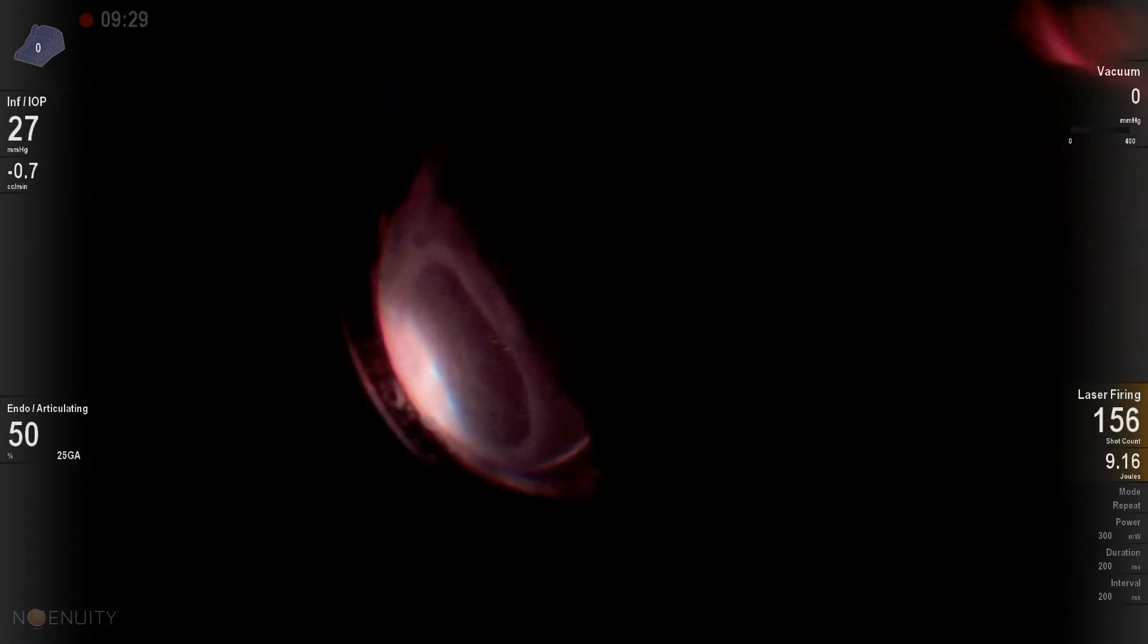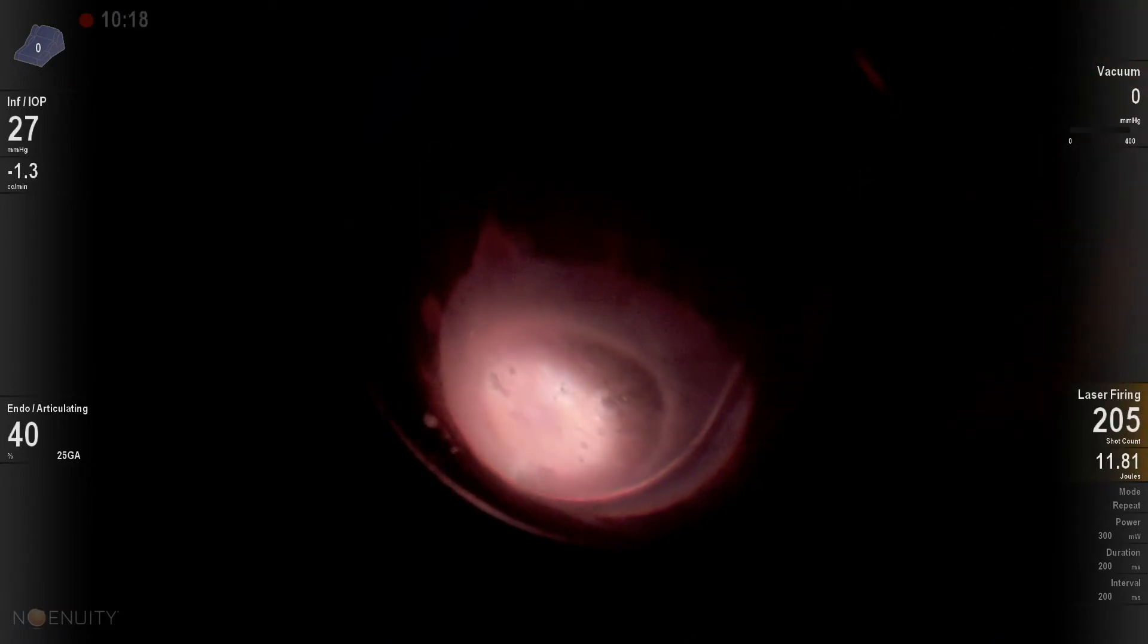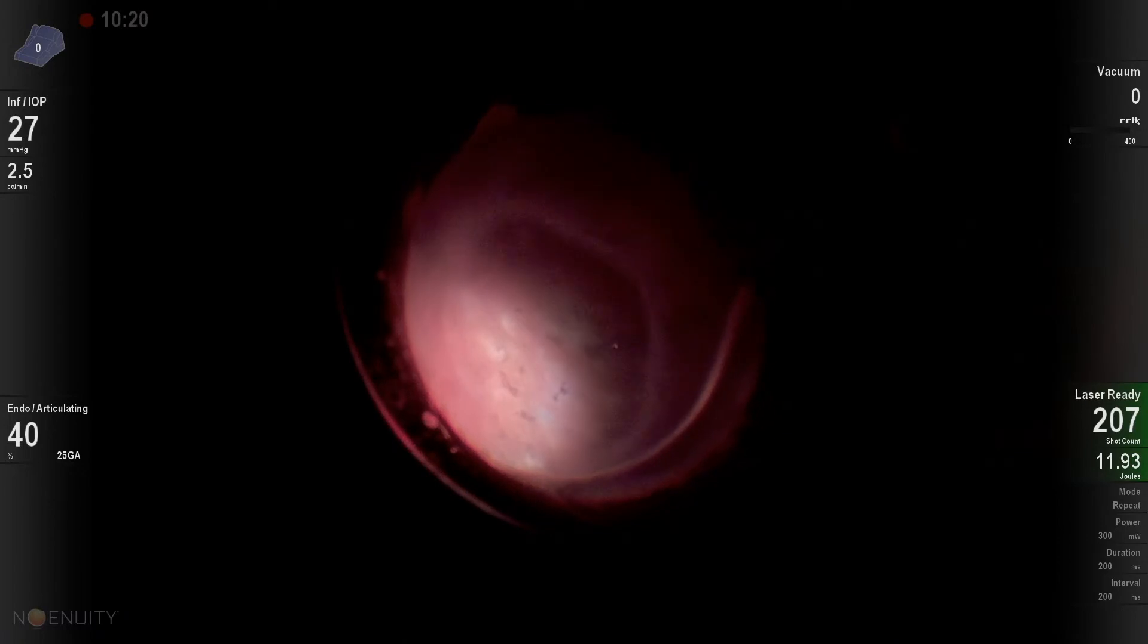We just leave that Ozurdex there. Sometimes it would move around with the fluidics inside the eye. Most of the time it would stay fairly stable.